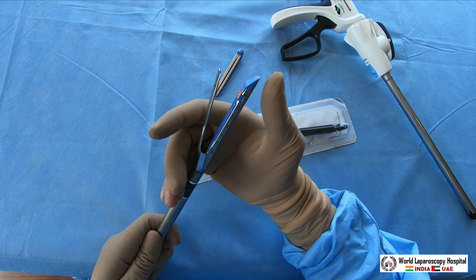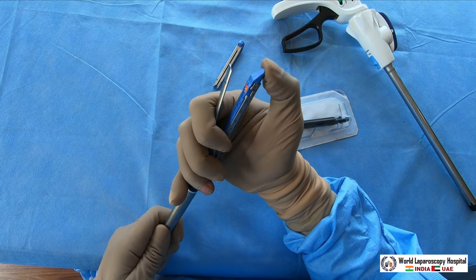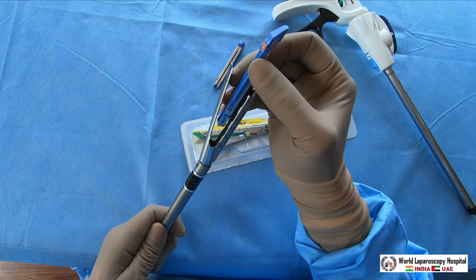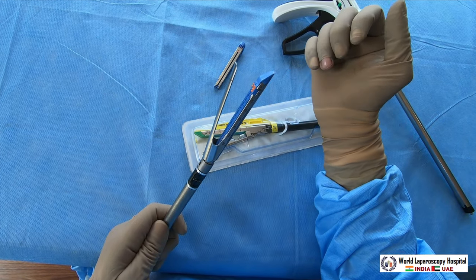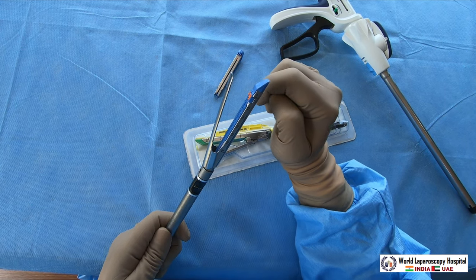To remove the cartridge, place three fingers here and the thumb here, and as soon as you press it, it will come out. To attach, hold it gently and press - it is attached. All the green, blue, or white cartridges are attached similarly.